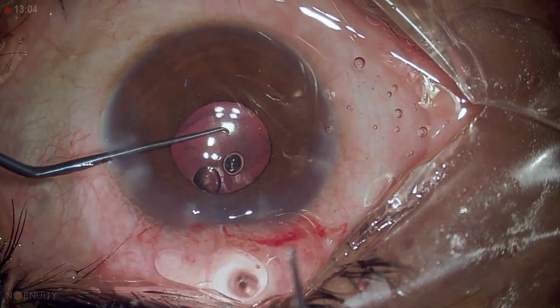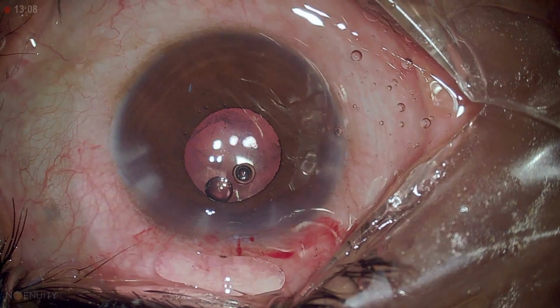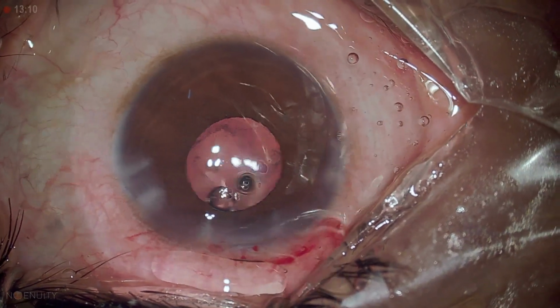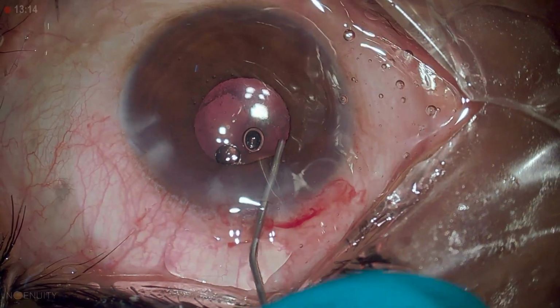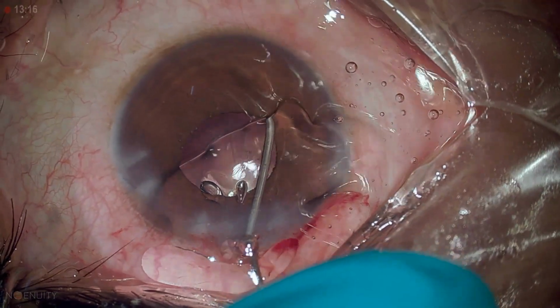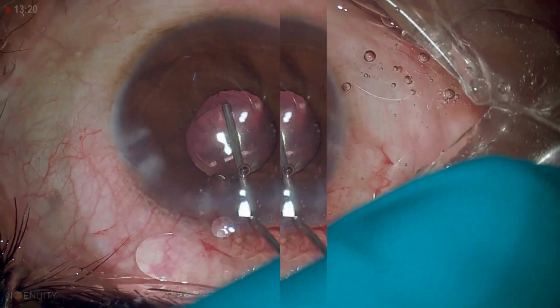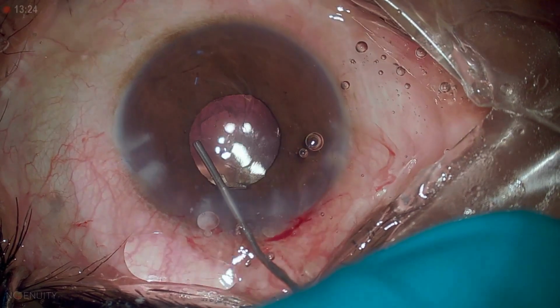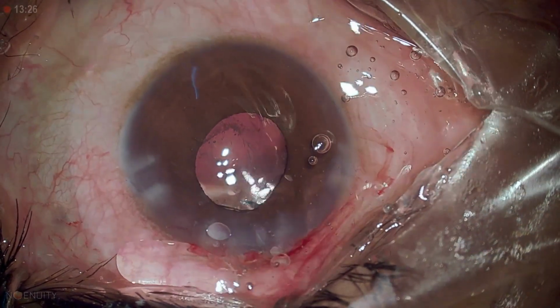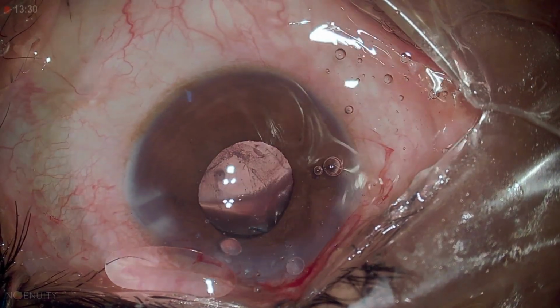So the optic is now tamponading the entire silicone oil behind the posterior capsule and is not allowing that silicone oil to come forward. And once that is done, you form the chamber, hydrate the wounds, and finish the surgery.